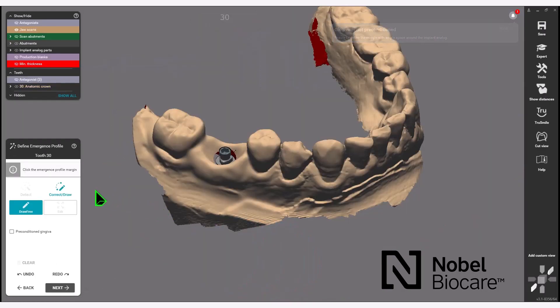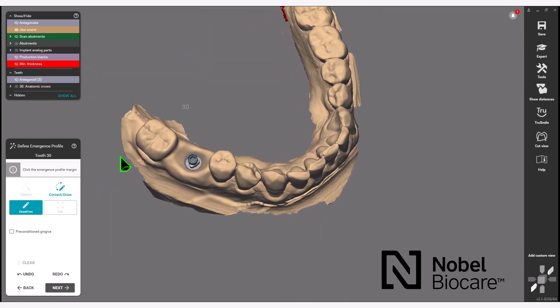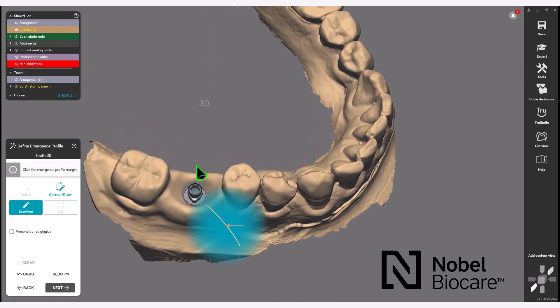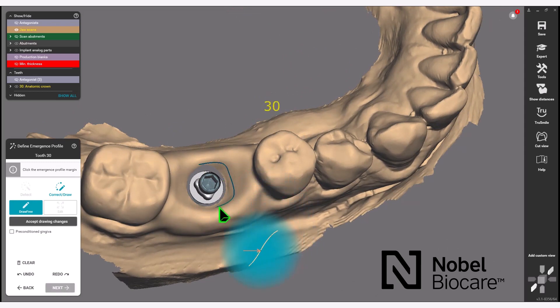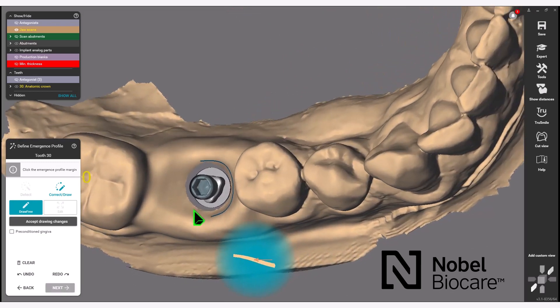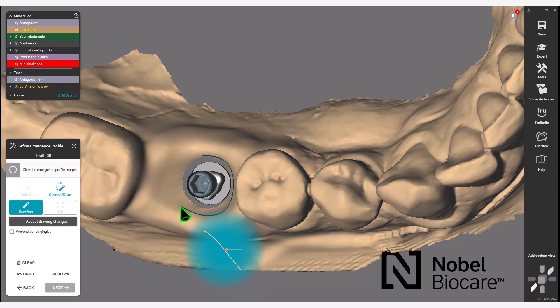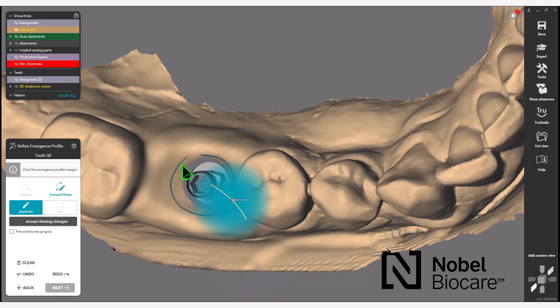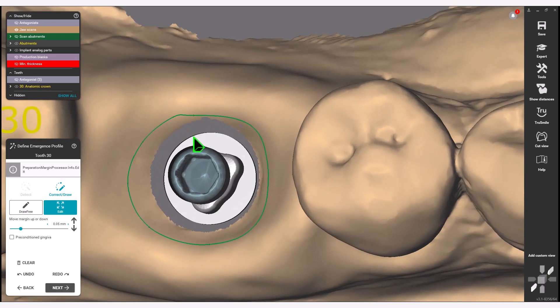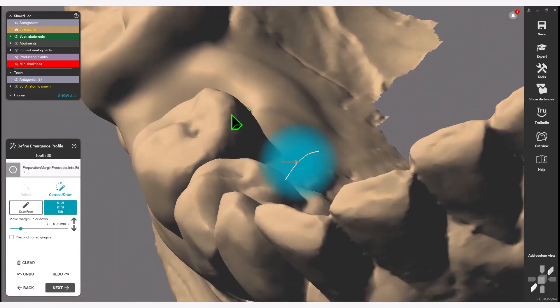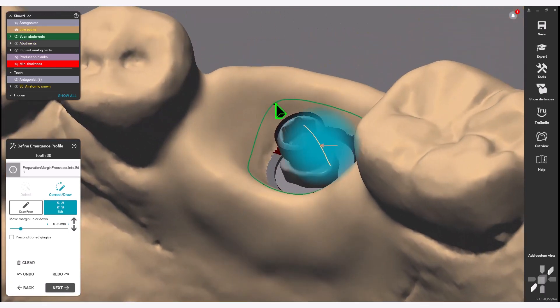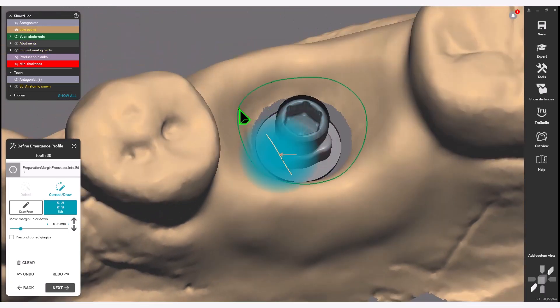In the Define Emergence Profile section, select either the correct or detect option to indicate the margin of your emergence profile. Double-click to close the loop, then click along the line to add any further points and adjust those points to design your desired emergence profile.